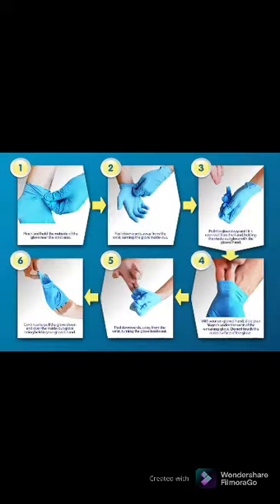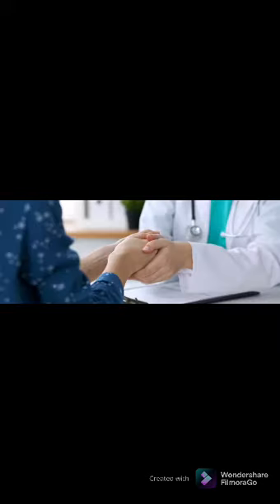Discard collection unit. Label your tubes. Observe special handling instructions. Check patient's arm to see if it stopped bleeding and apply bandage. Dispose of used and contaminated materials. Thank the patient, remove gloves, and sanitize your hands. Transport specimen to the laboratory.